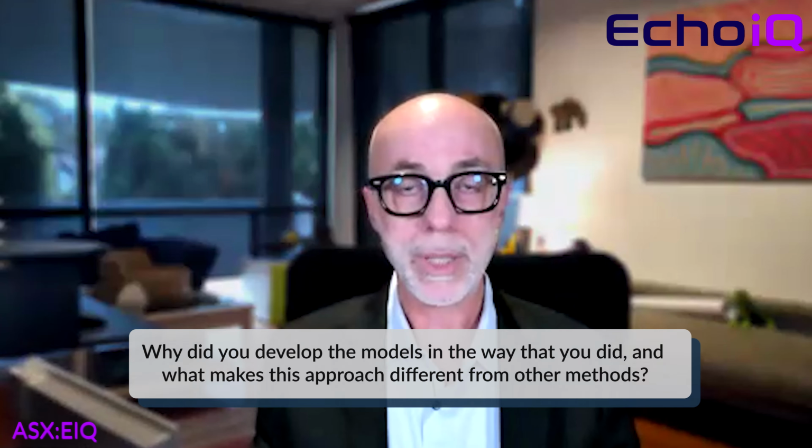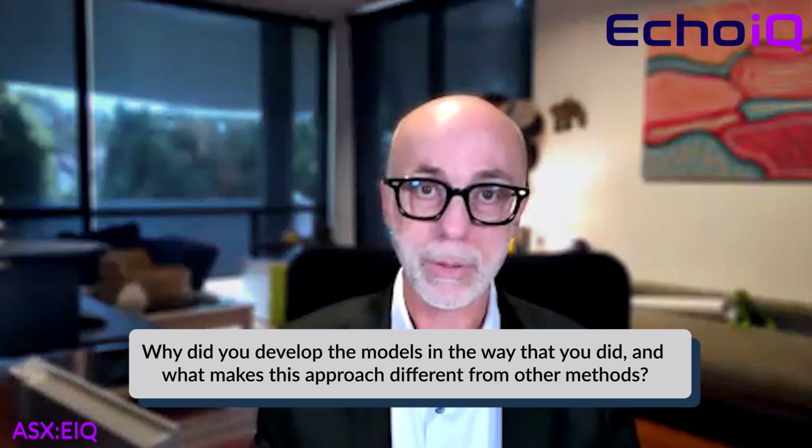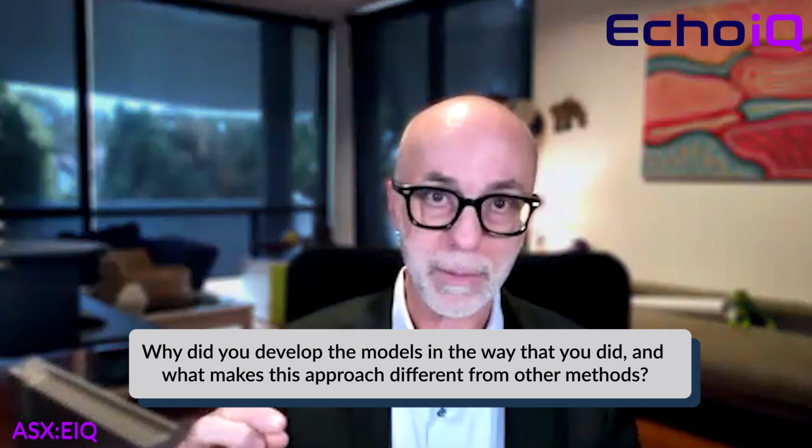What we developed was a technology designed to automatically identify the severe AS phenotype. And when I say phenotype, I'm really talking about the set of abnormalities that go together in severe aortic stenosis. Things like left ventricular diastolic dysfunction, systolic dysfunction, increased filling pressure, left atrial dilatation, pulmonary hypertension, and right heart changes, the so-called cardiac phenotype or the cardiac damage score.